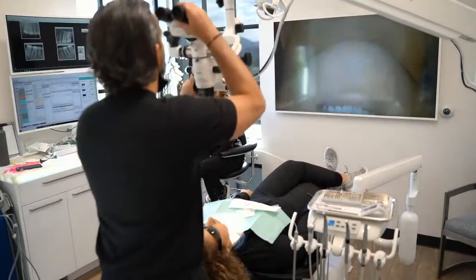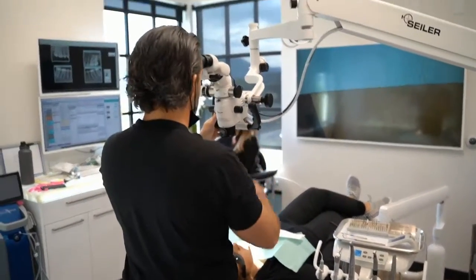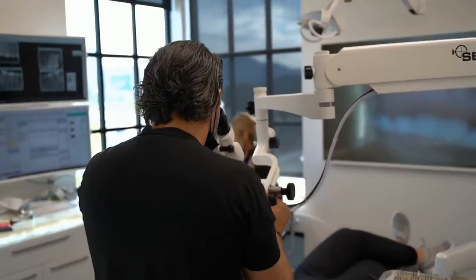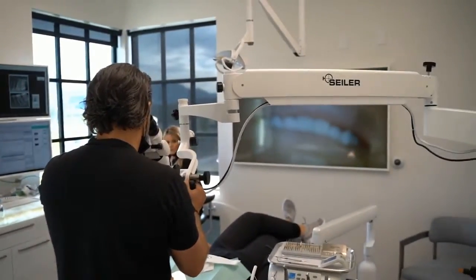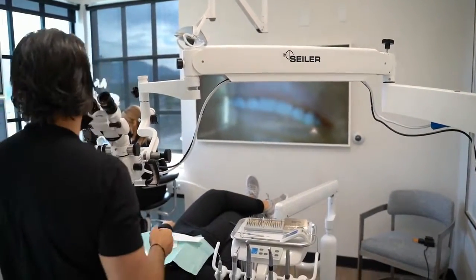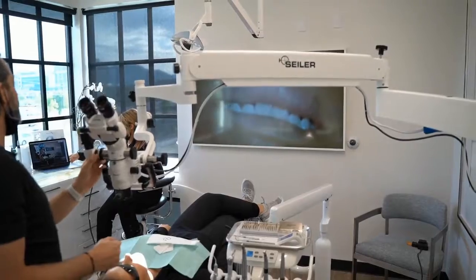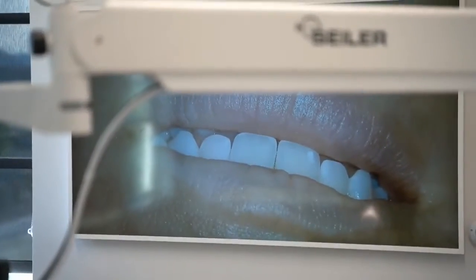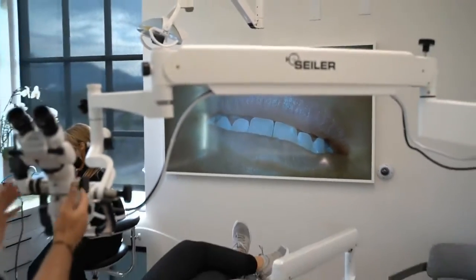But I would never be able to be in focus, nor is there a working distance here, if I were to focus here standing up. In my eyes, now I'm in focus by what I see, totally out of focus on that screen, and I can bring her into focus right here. So I like that video documentation ability of this beam splitter.